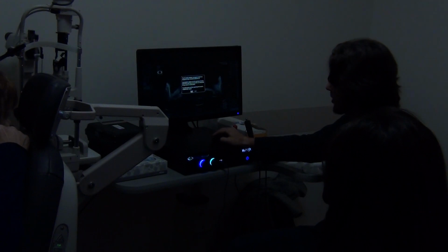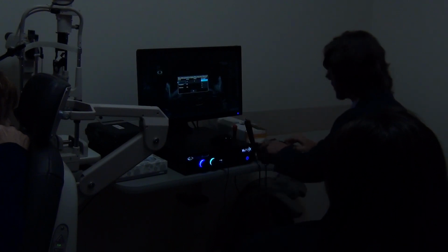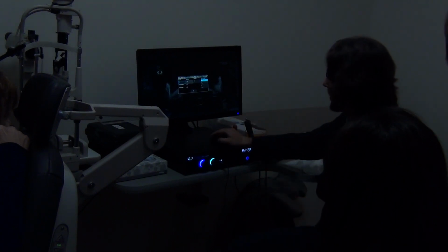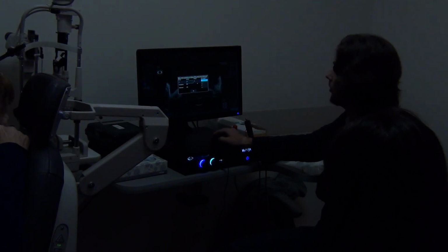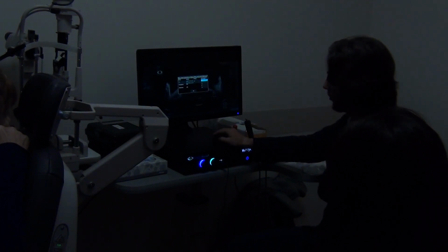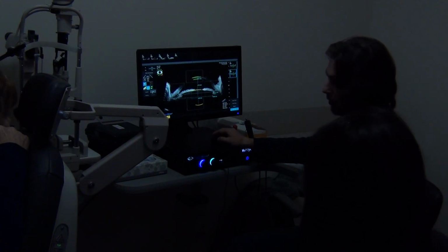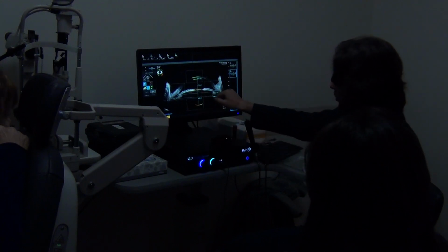And Kajima the same way. So we put sulcus to sulcus manually here. ACD is recommended to put on, and then the unit will provide you the size of the lens when needed. So you kind of manually fill out those fields here. So those two nomograms are available. Doctors can use it straight from here, or if they'd like to do any other nomograms, they can go online and just pick it up. But your sulcus to sulcus measurement will be here.